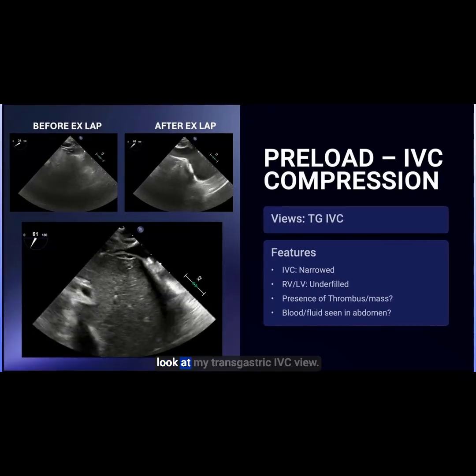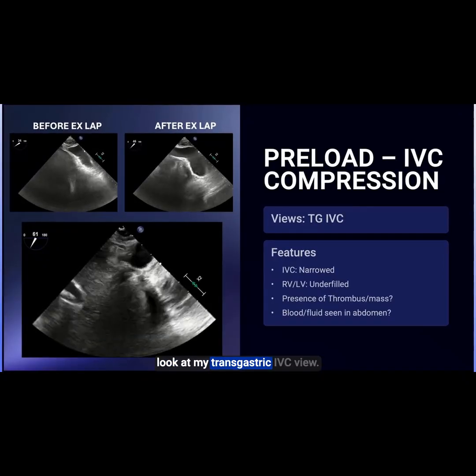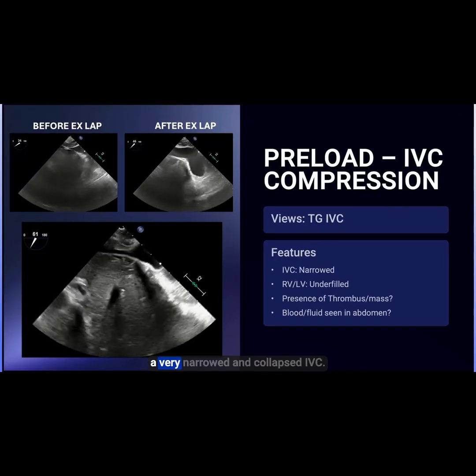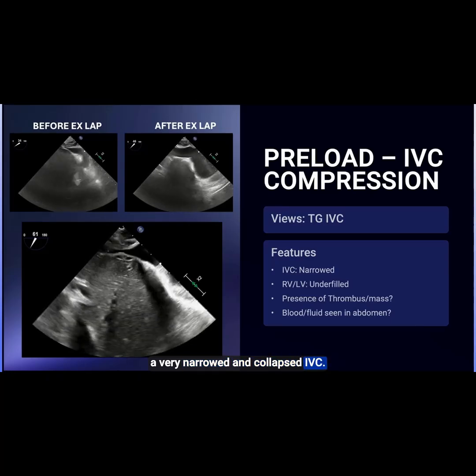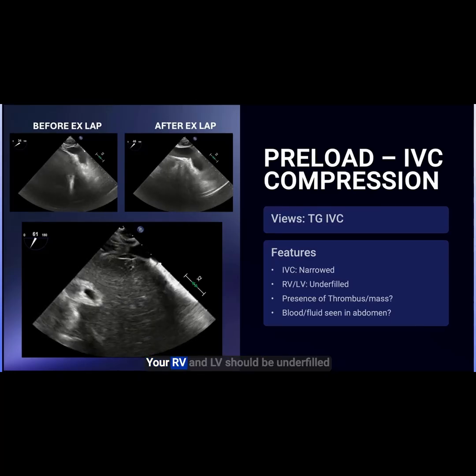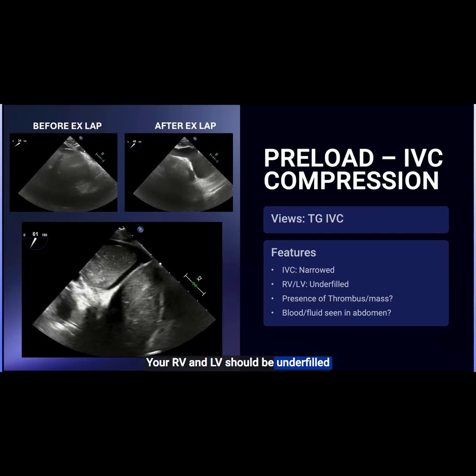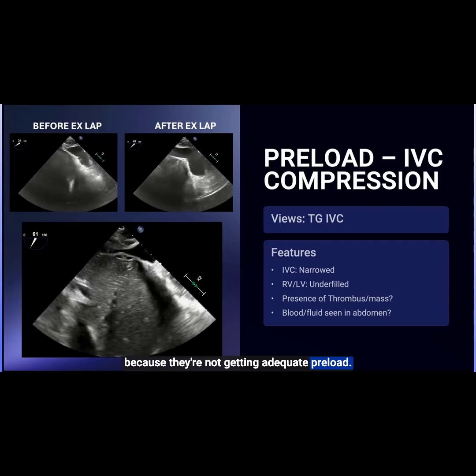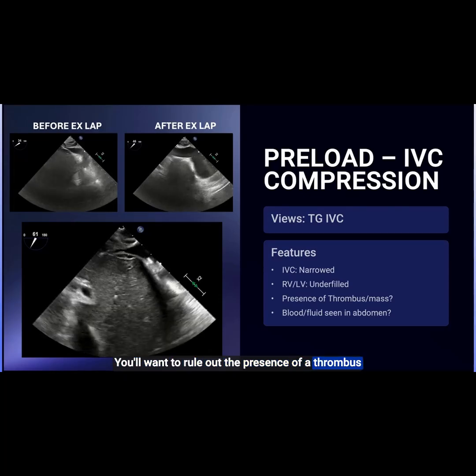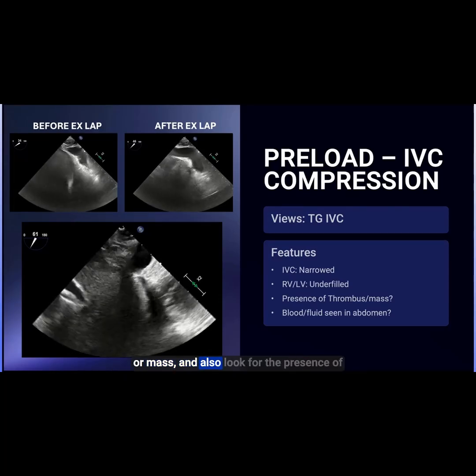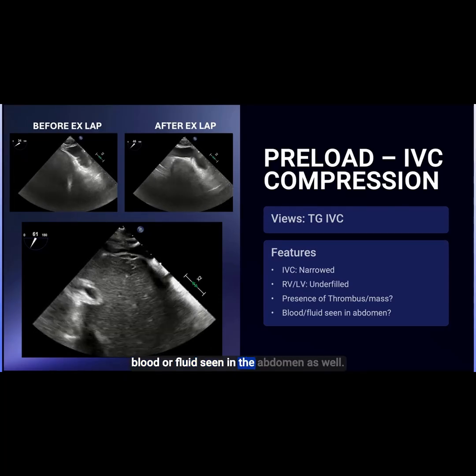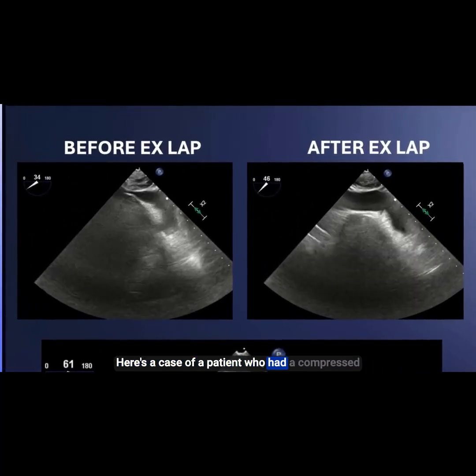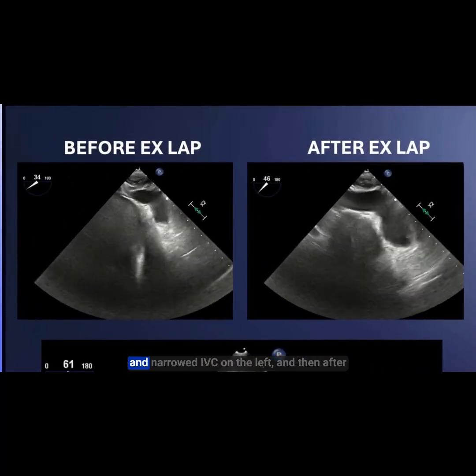To evaluate for this with echo, I'll look at the transgastric IVC view. Some of the features you may see are a very narrowed and collapsed IVC. The RV and LV should be underfilled because they're not getting adequate preload. You'll want to rule out the presence of a thrombus or mass and also look for blood or fluid in the abdomen.